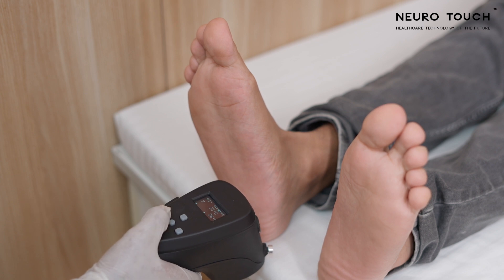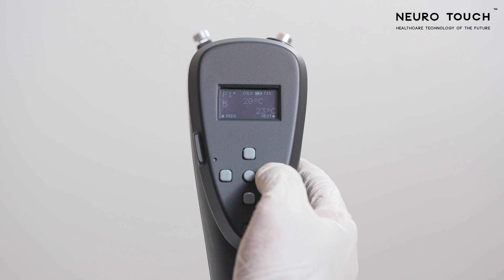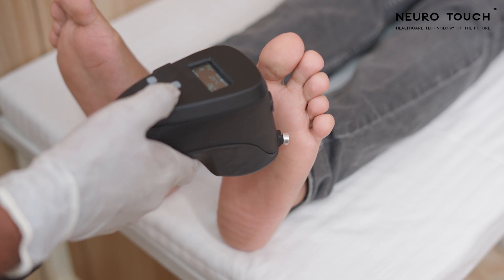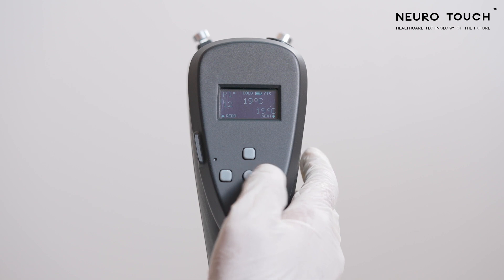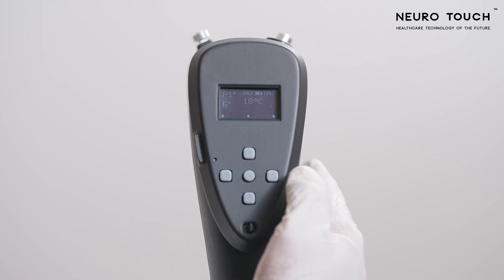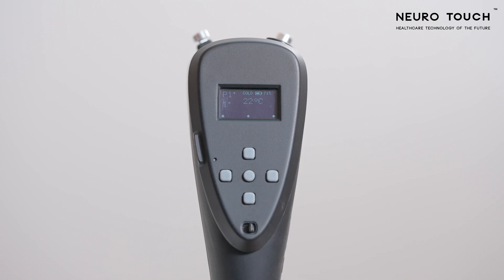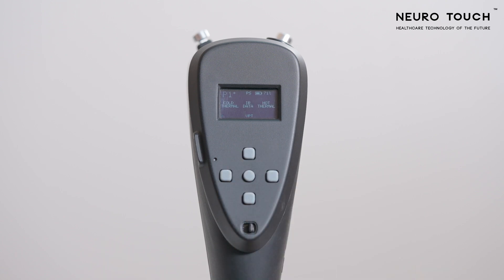If the patient can feel the coldness, press the center and right keys to save the data. The test proceeds to the next test point. After screening all 12 test points, the display will come back to test point 1 with a star next to it. The star indicates that the data has been saved at that particular test point. Check all the points to see whether you have missed any, and redo the test if needed. Come back to the home screen by long pressing the left key.